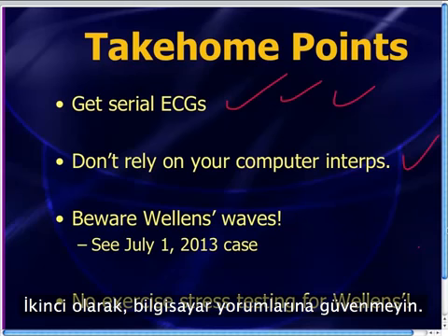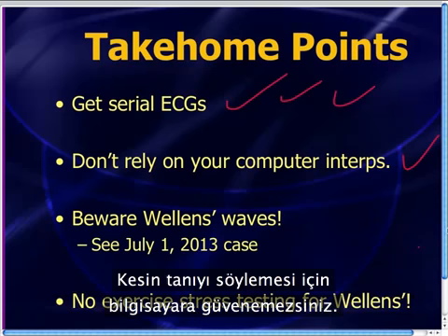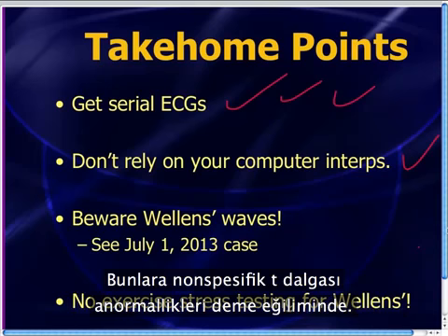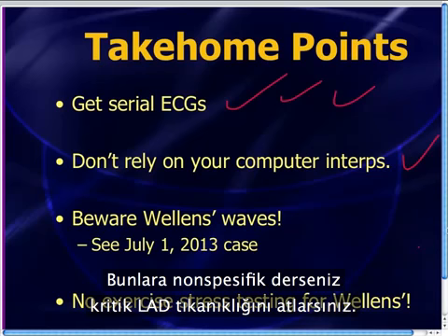Secondly, don't rely on your computer interpretations for the 100th time probably on these videos. You cannot rely on your computer to tell you the proper diagnosis. And especially with Wellens, your computer will not detect or will not diagnose that Wellens type 2 or the biphasic type of Wellens waves. It has a tendency to call those non-specific T-wave abnormality, and it's not non-specific. If you call it non-specific, you can really be missing a critical LAD occlusion.